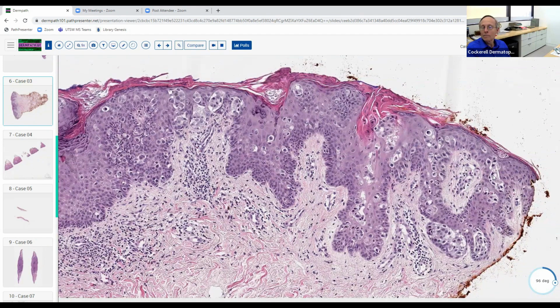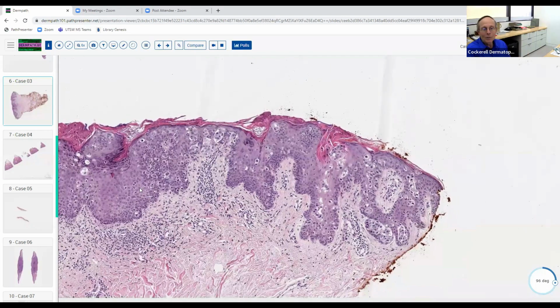And actually, as I recall, they used to ask this question on the boards back when I took the boards in the 1980s. They used to ask which had the lower pH. And I believe that was Jim Graham's favorite question. And it was basically, I believe, the sialomucin has a lower pH than the hyaluronic acid. So not that it matters. You don't need to know that anymore.